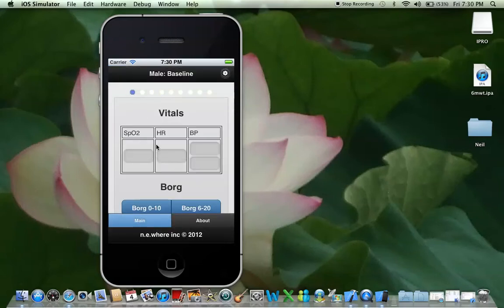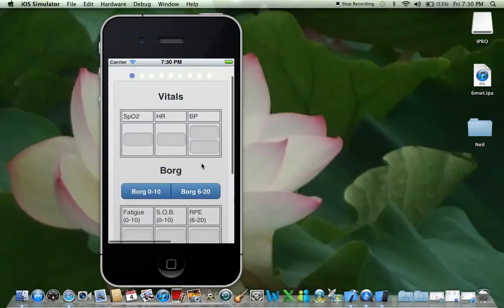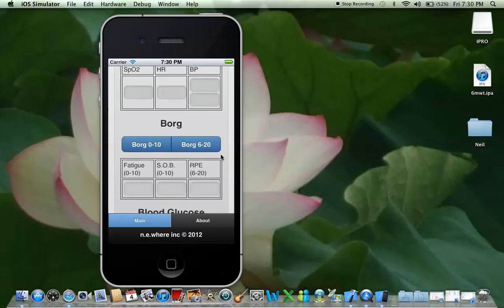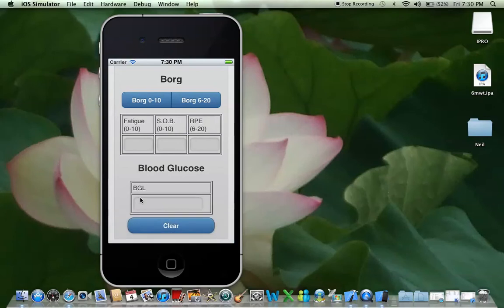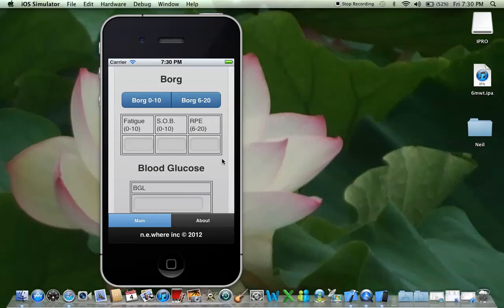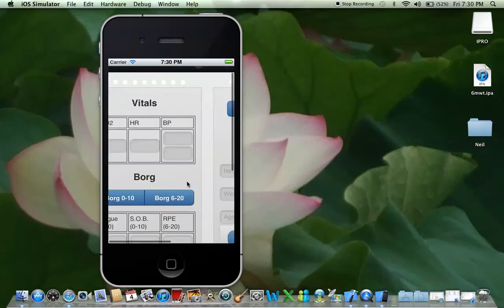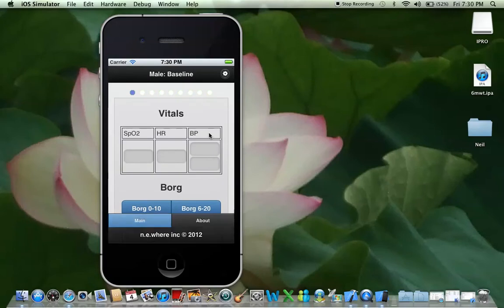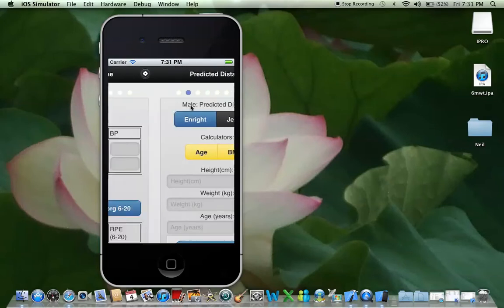You can press either back button and it'll come back to wherever you were. You've also got your blood glucose level here if needed. Looking at this first page, you've got the dots which indicate which step or page you're on. I can't swipe back because there's no previous pages, but I can swipe to the next page.